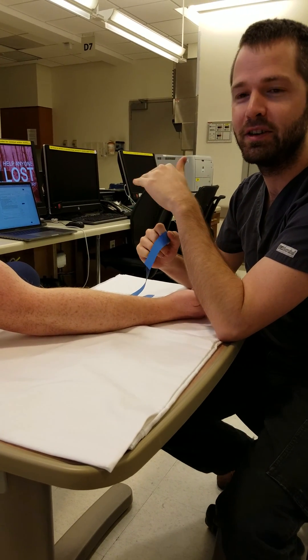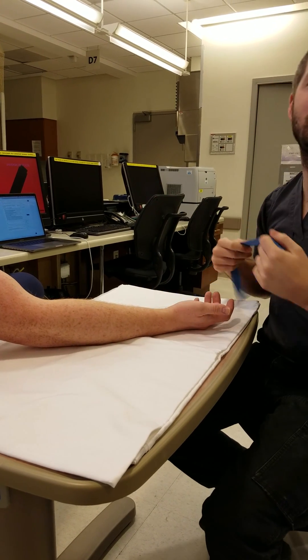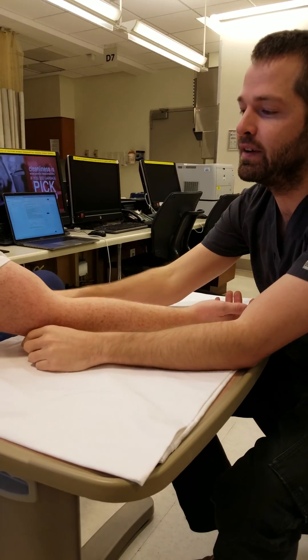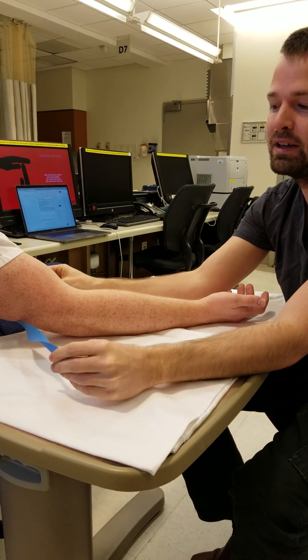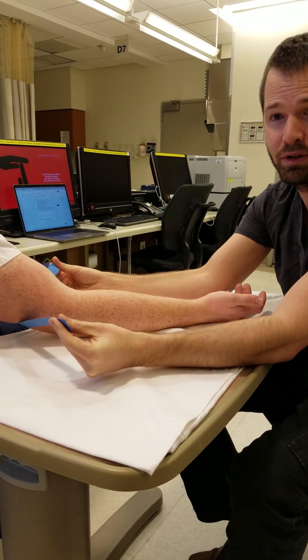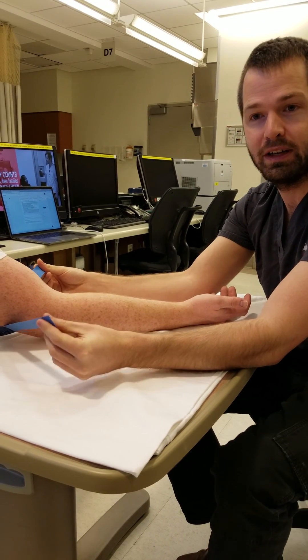If you put on a tourniquet and it hurts, you're doing it wrong. And most importantly, watch other people put on tourniquets — the tighter they put it on, the less confident they are in their ability to find a vein, or how panicked they are in the situation. If you notice that tourniquets are flat, rectangular objects, they're not meant to be twisted on their side or thin. They're meant to be thick to apply pressure to a greater surface area. So if you're pinching the skin or rolling the tourniquet, you're doing it wrong.